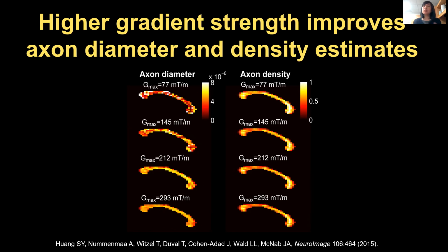And of note, I think these results have been reproduced by other groups that have now installed Connectome scanners worldwide, including the scanner out in Cardiff, led by Derek Jones and others. And then there's another one in Leipzig. And so these sorts of results are very much consistent when you look at them across different scanners of the same type.